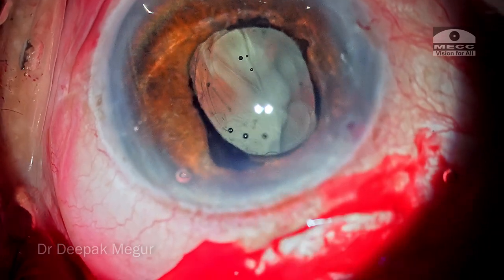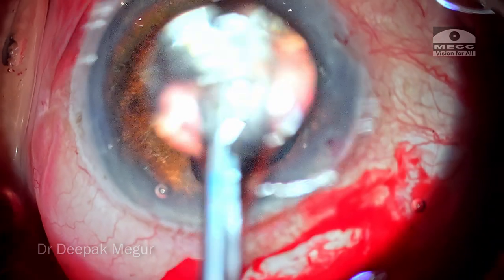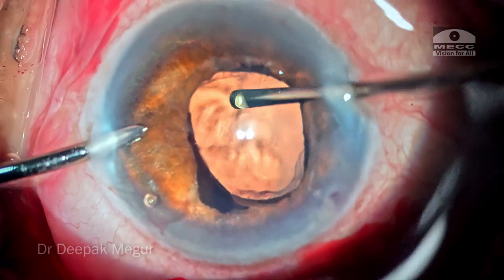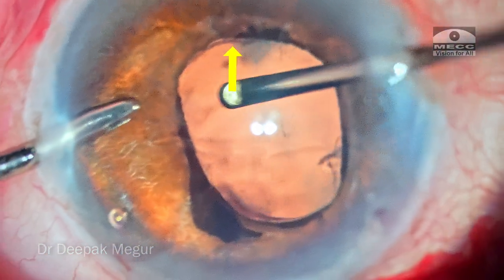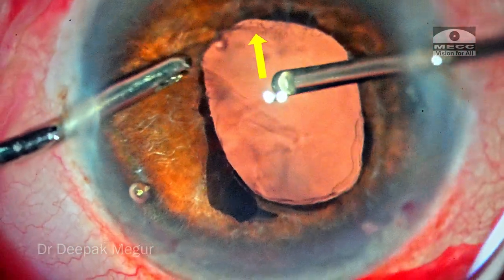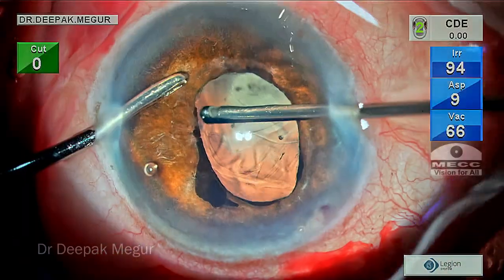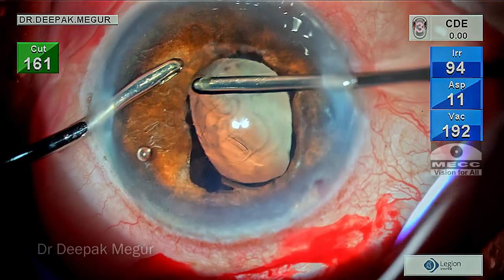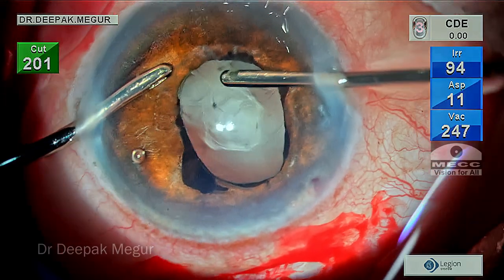Explanting the lens was very easy, but identifying the presence of vitreous initially and taking care of it was far more critical. I go in with my cutter once again to do some more anterior vitrectomy. At this time I notice there are some small inflammatory fibrils, or probably a combination of vitreous fibrils along with inflammatory membrane, sticking onto the anterior surface of the iris. I'm using the cutter itself in a very controlled manner to cut out all the membranes or small fibrils on the anterior surface.